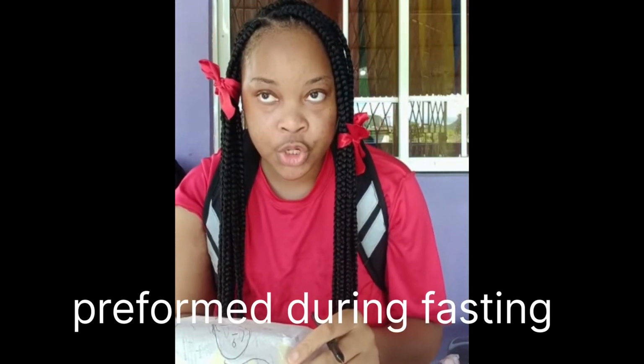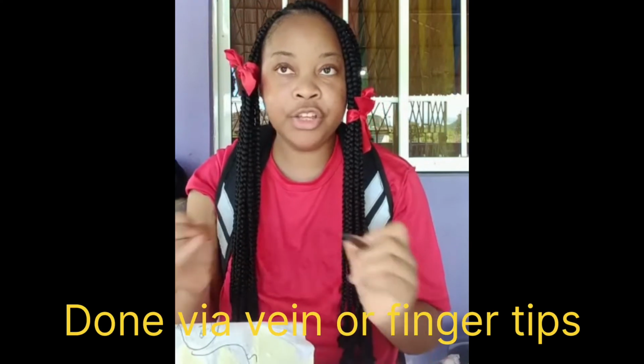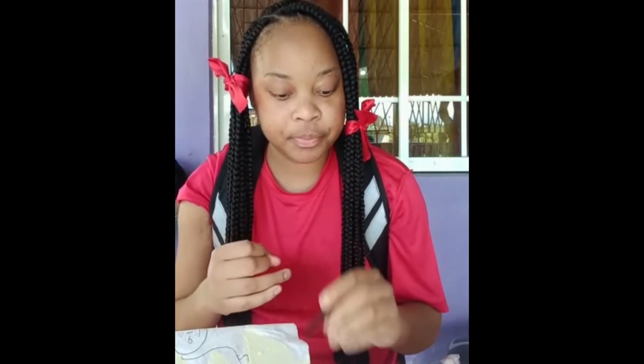Preparation of patients is that normally it is performed after fasting. So a patient has to undergo fasting. A healthcare professional will normally do it from either your vein or your fingertips. So a small needle, something like what I have here, is inserted in the arm, and you would normally feel a slight pinch. And for the fingertips, the test is normally done in a provider's office or in their home.